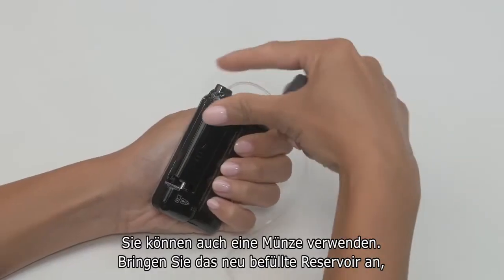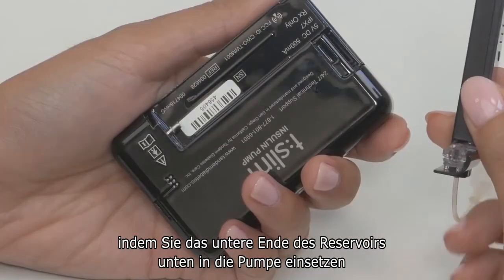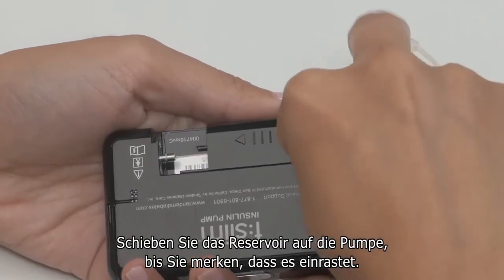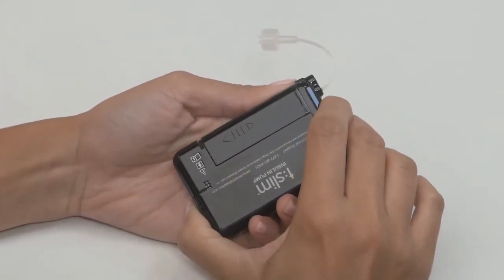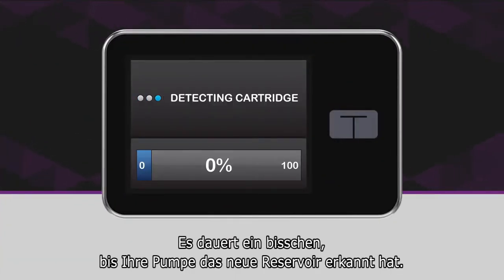You should see the Preparing for Cartridge screen. Remove your used cartridge using the removal tool — you can also use a coin. Install your newly filled cartridge by placing the bottom edge at the end of the pump and lining up the grooves on either side of the cartridge with the guide tracks on the pump. Once lined up properly, push the cartridge on until you feel it click into place. The cartridge should fit smoothly against the pump. Your pump will take a few moments to detect the newly installed cartridge.